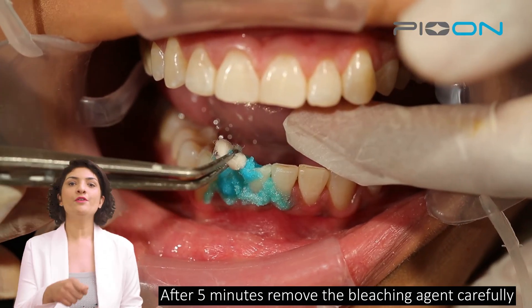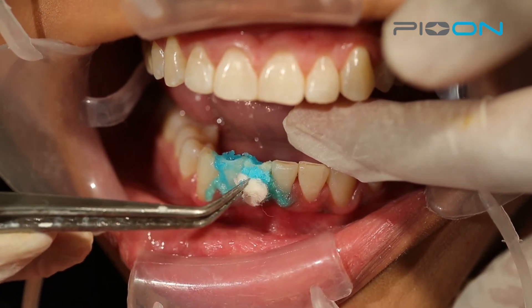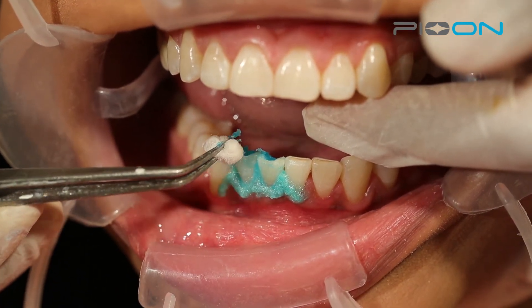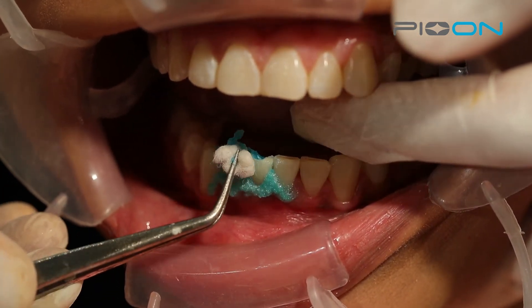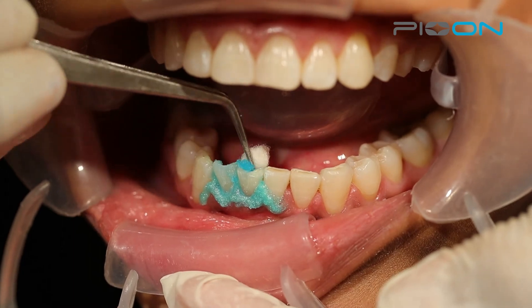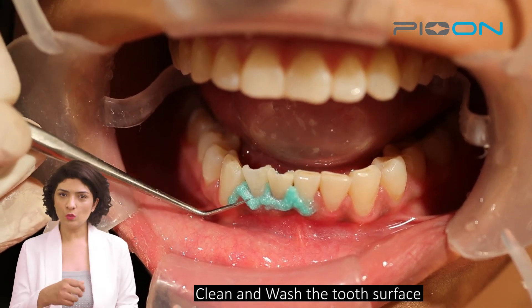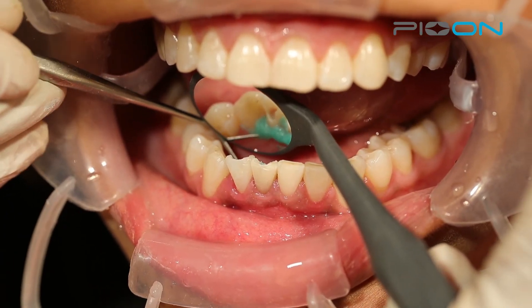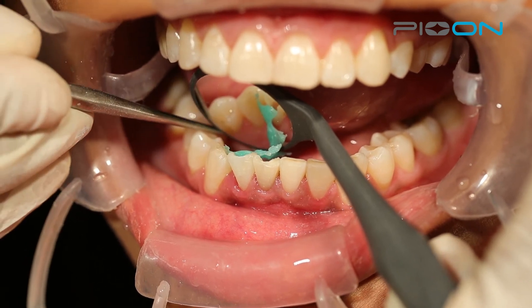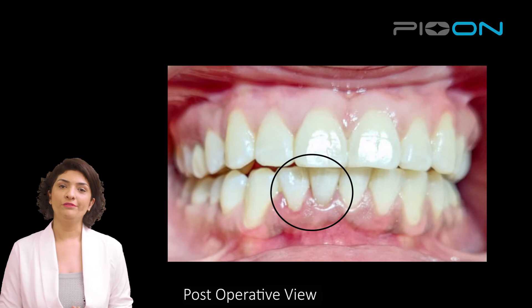After 5 minutes, we will remove the bleaching agent, clean the tooth surfaces, and remove the gingival barrier. Here is the postoperative view of the case.